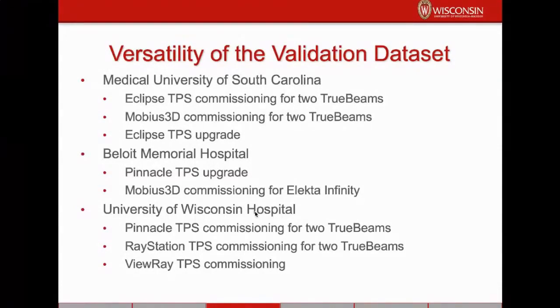Back in 2013 was the first time I used Medical Physics Practice Guideline 5A, and it was used to commission the Eclipse treatment planning system for 2 new TrueBeams. After that, we commissioned Mobius 3D for our secondary dose calculation algorithm for our new treatment plans. And we did that for the TrueBeams that we had just commissioned.